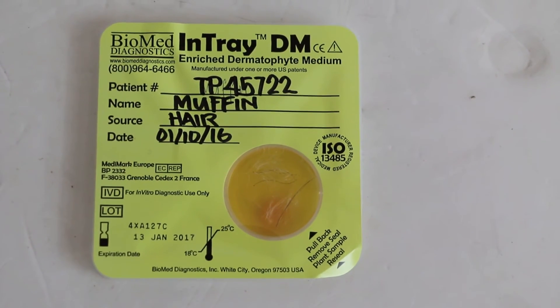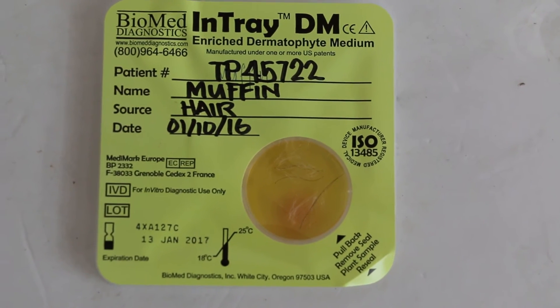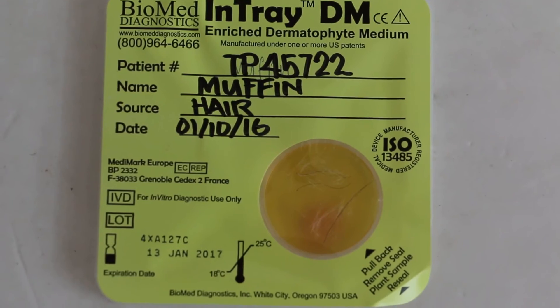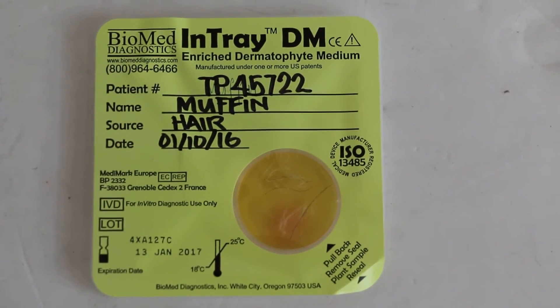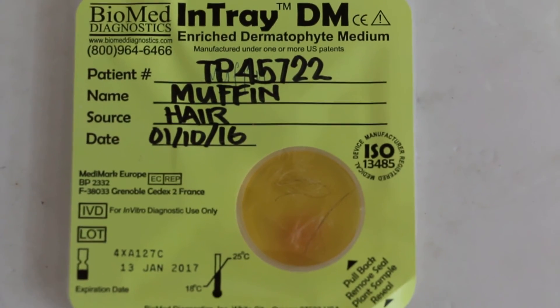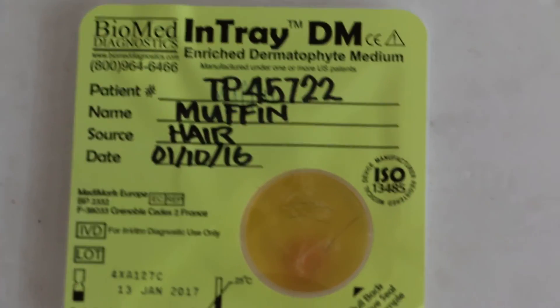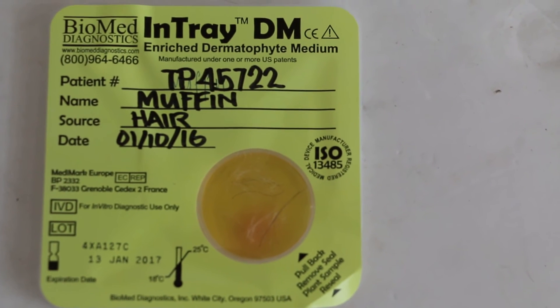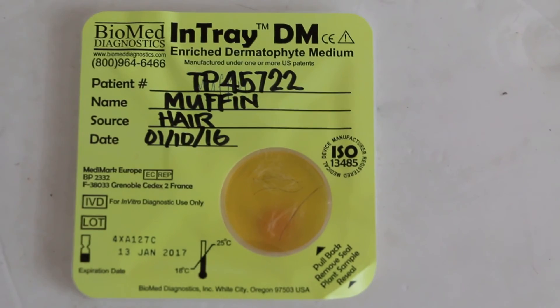Today is the 3rd of October 2016. We checked the InTray and as you can see, one of the two inoculated areas has changed red in color, showing the presence of dermatophyte being cultured. We will put it back into the dark area and check again in another 2 days. This more or less confirms there is dermatophyte in the hair which we took out for culture. Note that the InTray DM test costs about $100 and so many owners don't want to use it. Now we need to check under the microscope as to what type of dermatophyte it is.